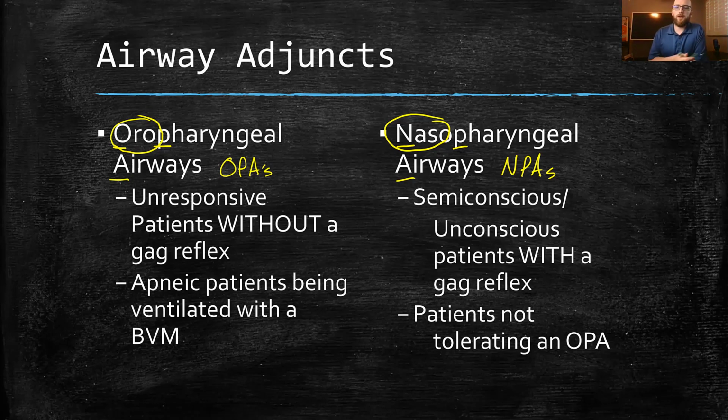So semi-conscious or unconscious patients with a gag reflex, or a patient not tolerating an OPA for whatever reason, are really the kind of indications that we have for using an NPA.